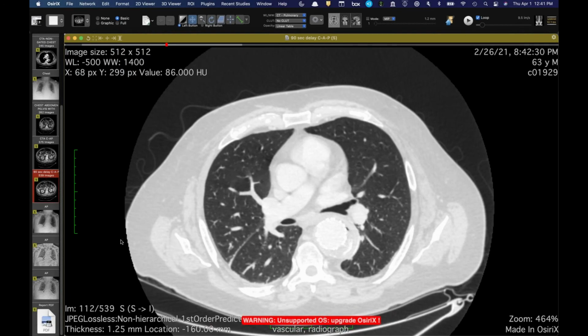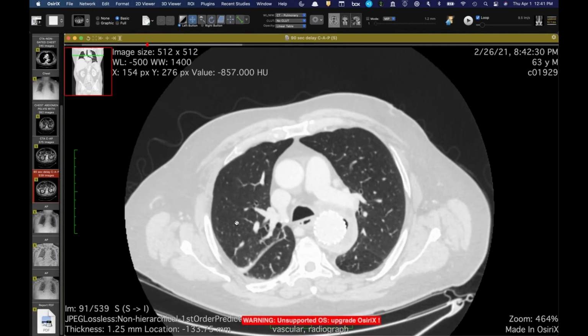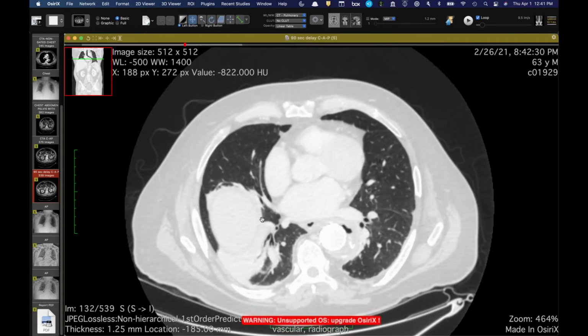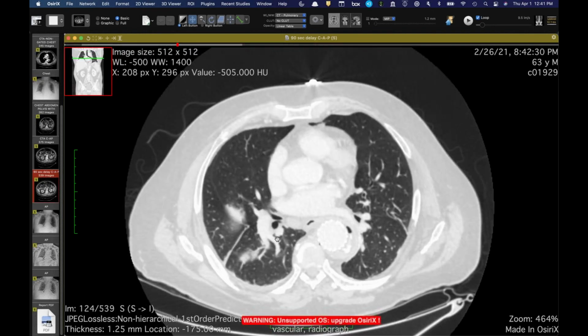So I was just showing it, mostly for the interesting findings on the radiograph. Were there any? I had a similar case, and Pugach a long time ago said, because I couldn't see a fistula, you're not going to get a gas forming organism. It's got to be a fistula, and he was eventually right.